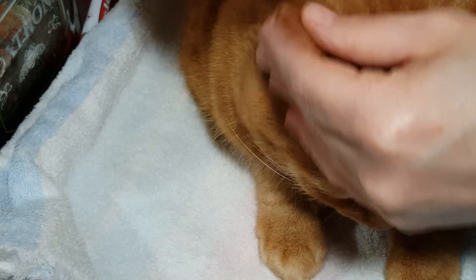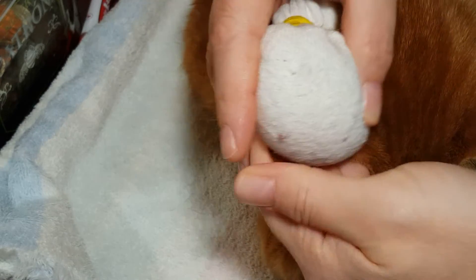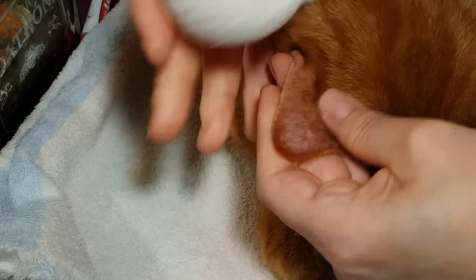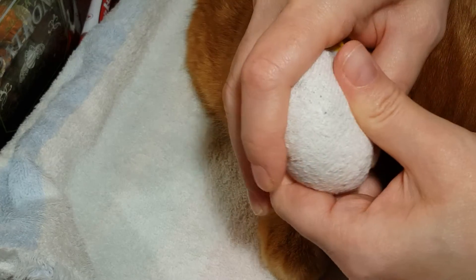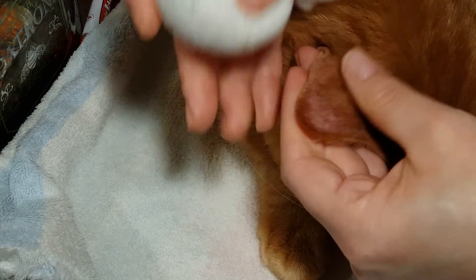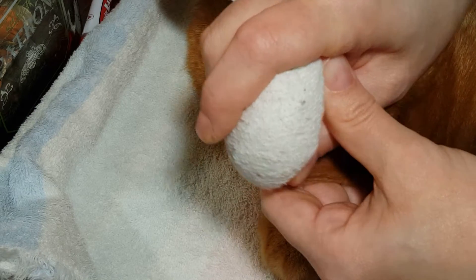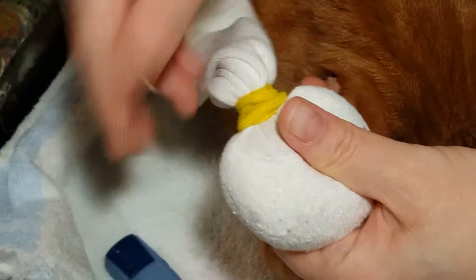Go ahead and get a test strip — it's important to have everything out and ready to go. Then just gently rub the ear with the warm sock. The warmth of the sock and the rubbing motion combined will make the ear get warm and red; you're making blood come to the surface of the ear. Have your lancet already ready, drawn back and ready to go — no fuss.